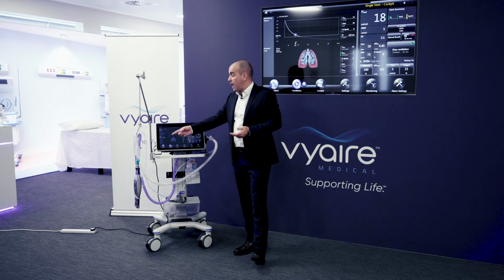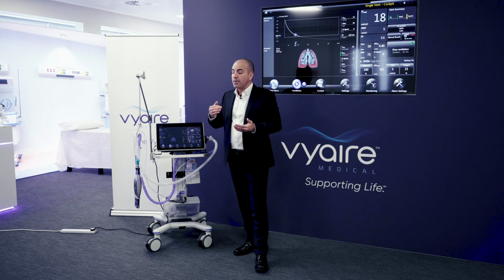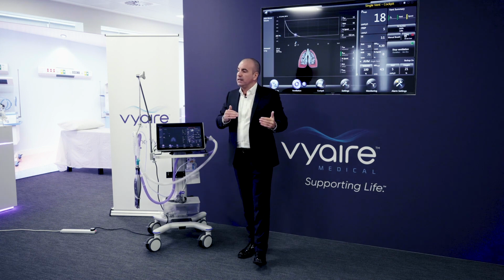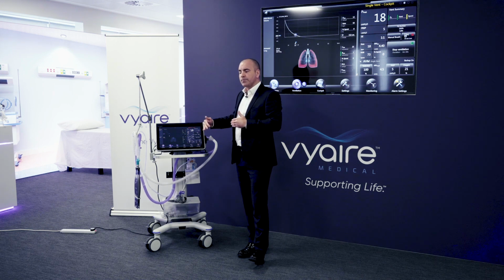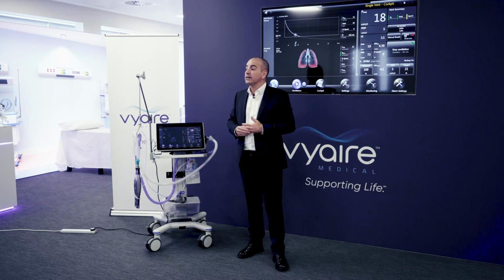Being able to switch between invasive and non-invasive, as I was saying when I opened, we can go toe-to-toe with the market leaders in non-invasive. We found out, well, what is your flow capability? Well, we're going to match that. And then we've added our own synchrony tools as well, so that they don't have to have several devices that need maintenance and training and the like.